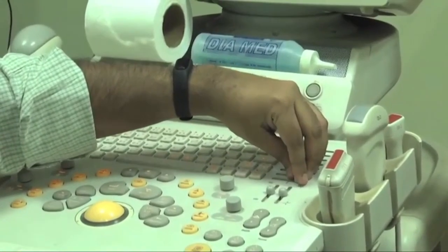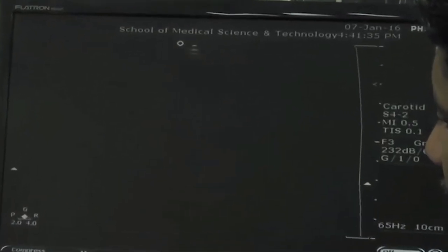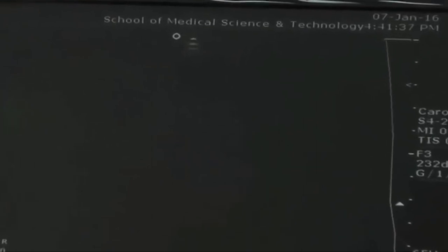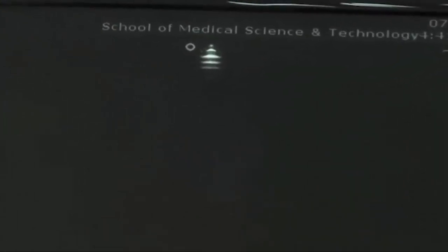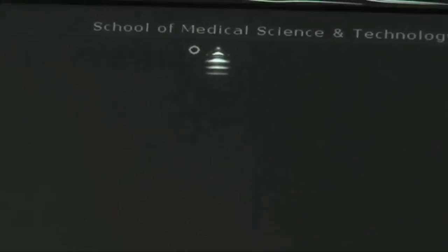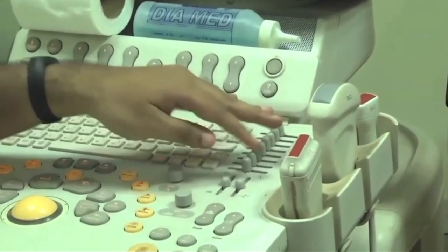If you look at that screen over there, you can see that as I keep changing these parameters, there is a gain factor which is changing, shown as a curve. Generally we don't make any changes to this, other than the radiologist who has subjective jurisdiction over making these changes, because the machine is pre-calibrated and the systems are preset as to how to use it.